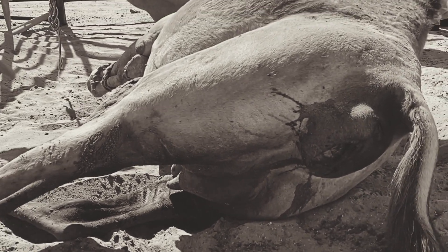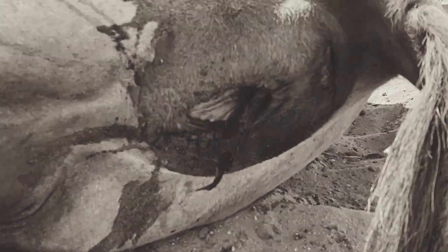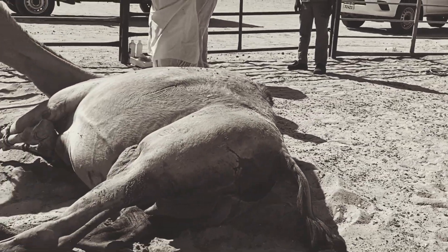Okay, let's proceed. I'll do the examination first. By the way, that's the tail of the fetus, so it's definitely a breach position. Let's go.